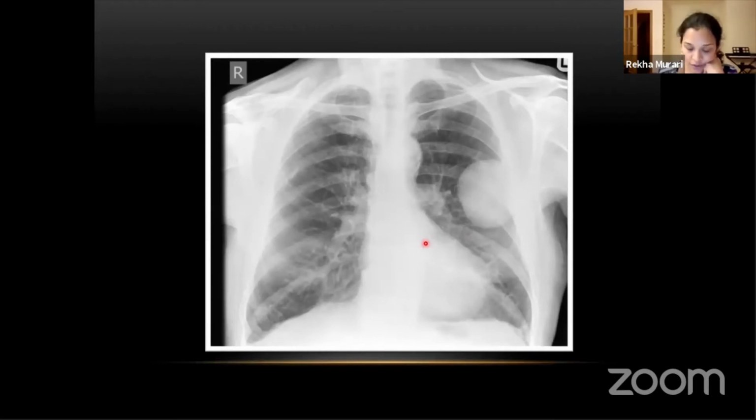Right, okay. What do you guys think of this one? Left-sided tumor, somebody says. Very good. Yes. Lung mass, yeah. I think it's pretty obvious. I've taken a really big lesion that's very obvious. But the more important thing is I wanted to discuss how we approach it when we see a solitary lung mass, which is also called a coin lesion.